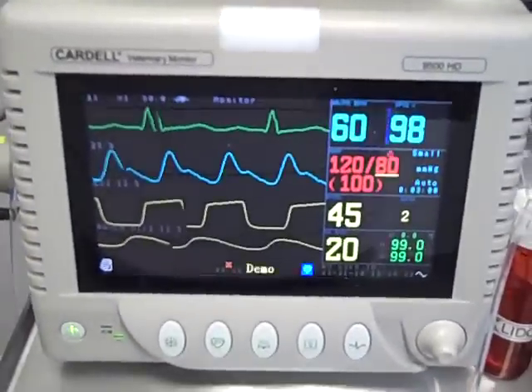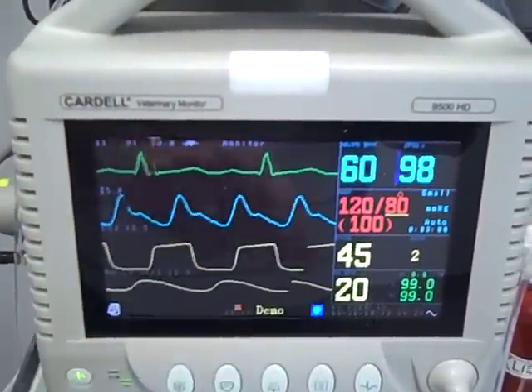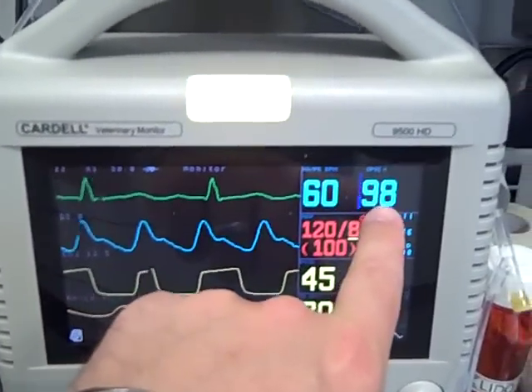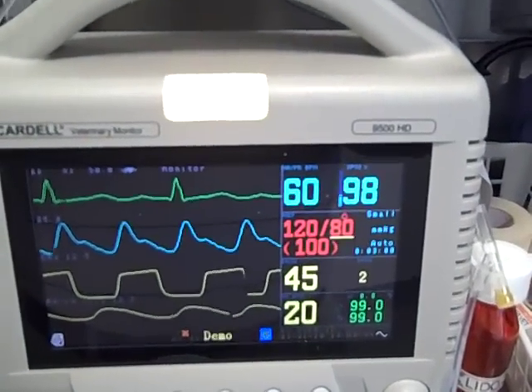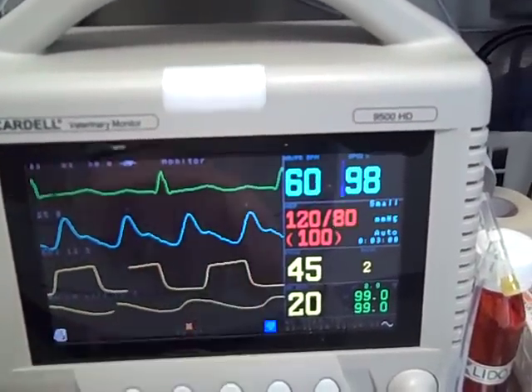This is their multi-parameter monitor. It does many different things including EKG. This is a heart rate and a pulse rate. This is 98, which stands for the oxygen saturation in the blood. This is a tracing of the pulse rate.